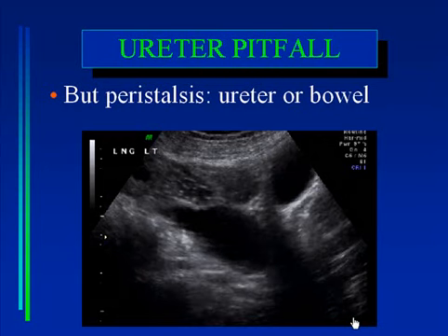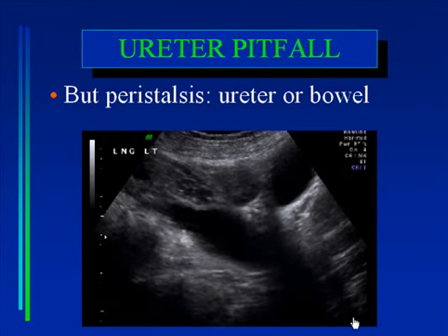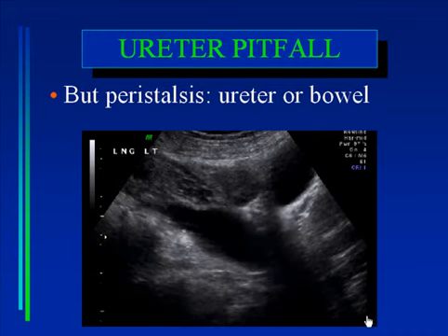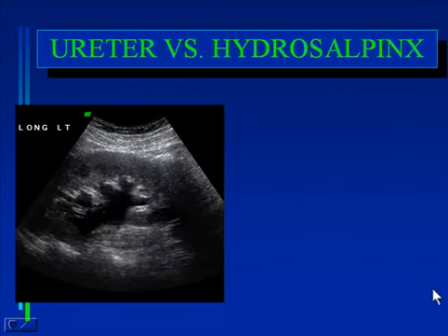The ureter is going to rise out of the pelvis eventually, go towards the kidney. Bowel will have a more tortuous appearance if you scan it long enough. And sure enough, when one scanned up in the flanks, there's pelvicaliectasis in this left kidney.